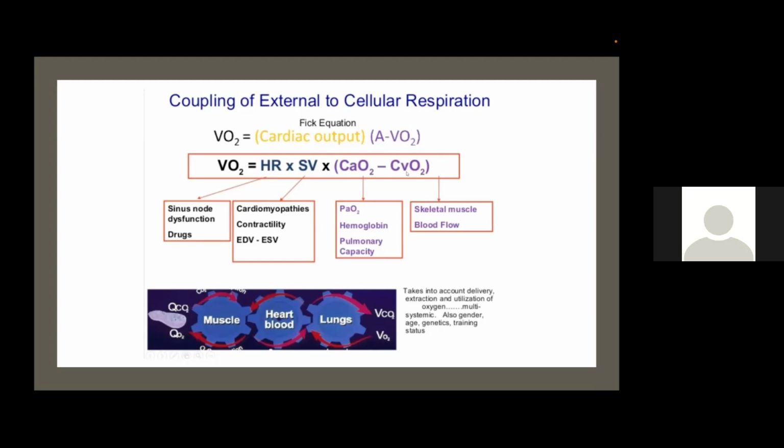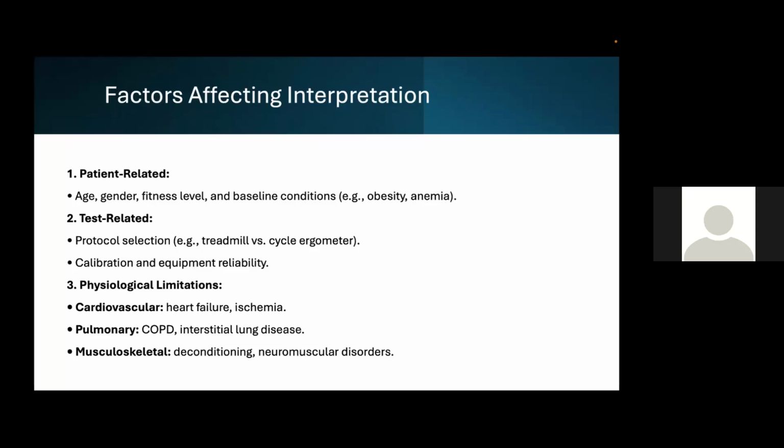So the factors affecting the interpretation of CPET, starting with the patient related: it varies with age, gender, and fitness level, and the baseline condition, obesity or anemia.